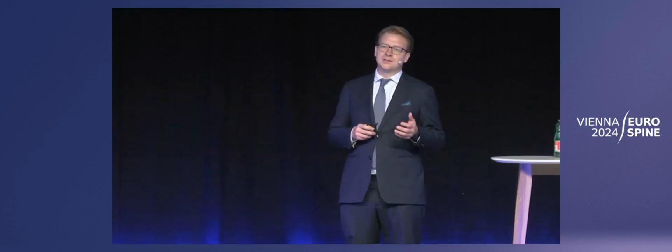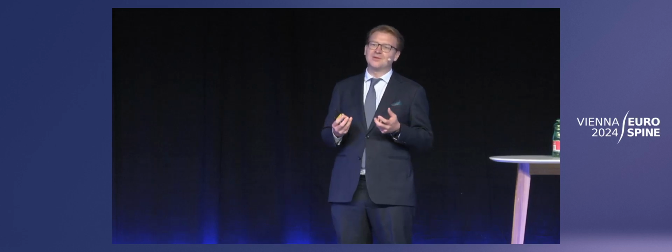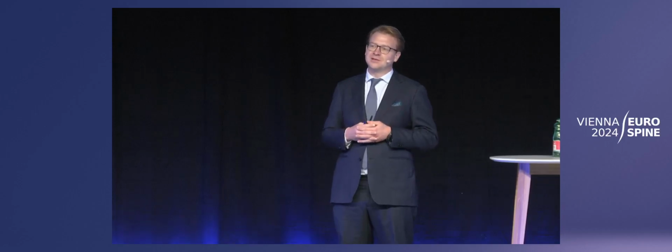Yeah, so we reason the other way around. We are now thinking of combining the two images. So combining the T2 images in the spinal canal with the segmentations of the bone on the synthetic CTs and fuse them into one image. That would be an option to visualize whether there are some neural compressions.